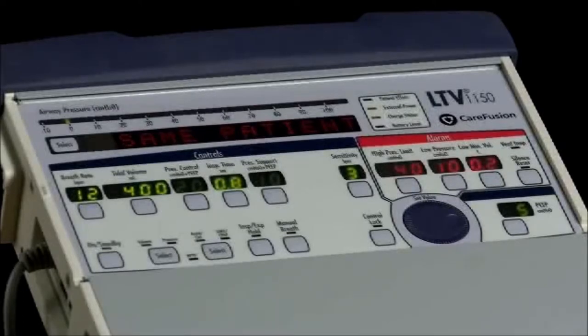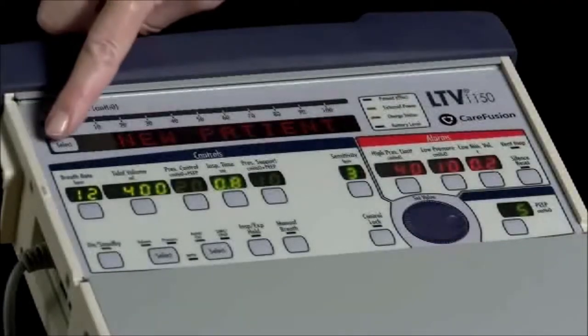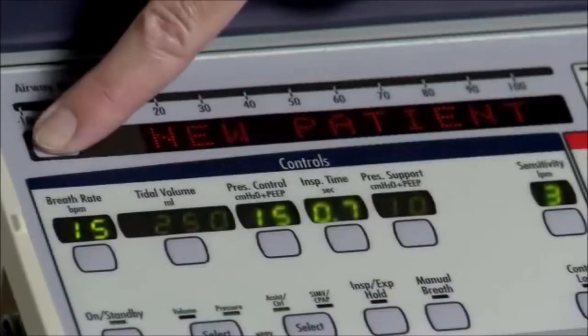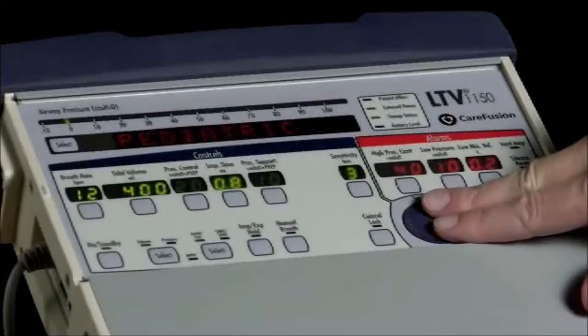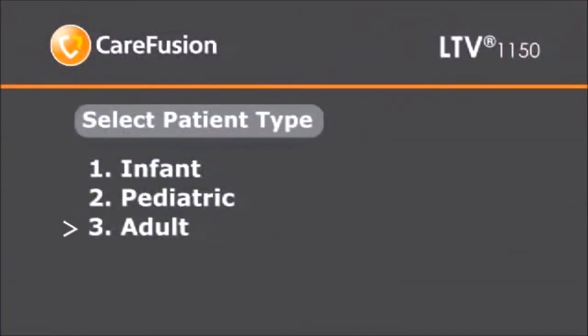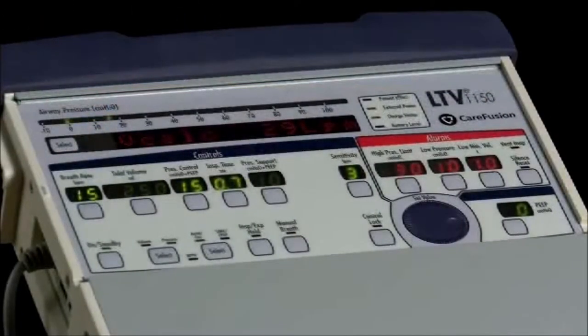If a new patient will be placed on the ventilator, turn the set value knob until "new patient" is displayed in the window. Now push the select button next to the display window. "Infant" will be displayed in the display window. Turn the set value knob until the desired patient type is displayed. Once the desired patient type is displayed, push the select button and ventilation will begin at the preset value for that patient type. If the patient query has been turned off, push the on/standby button once and the LTV 1150 ventilator will perform the POST. Once that is complete, ventilation will begin with the settings in use during the last power cycle.